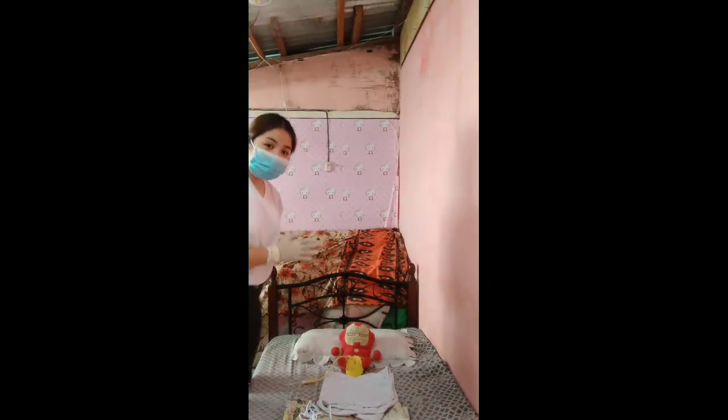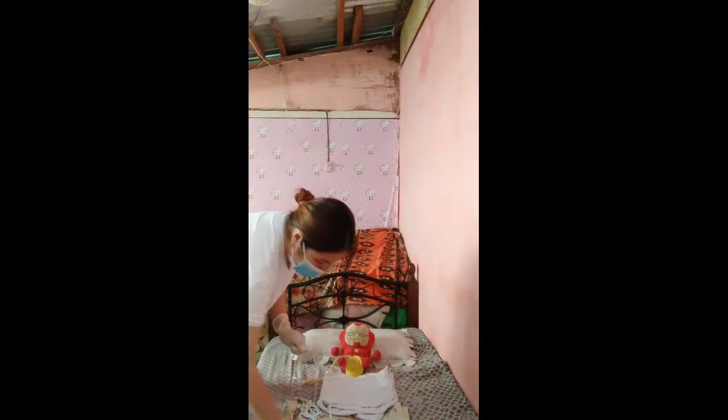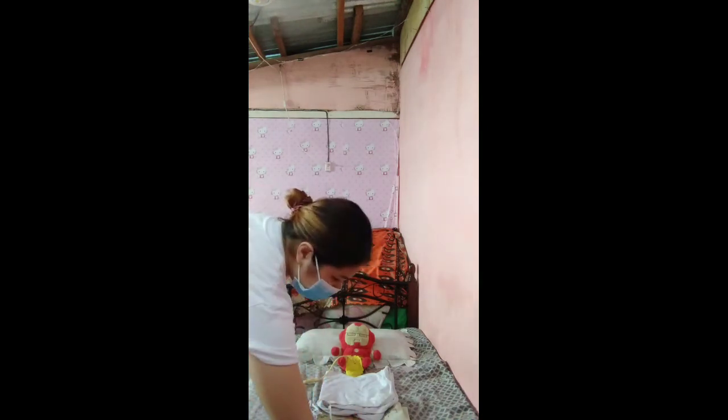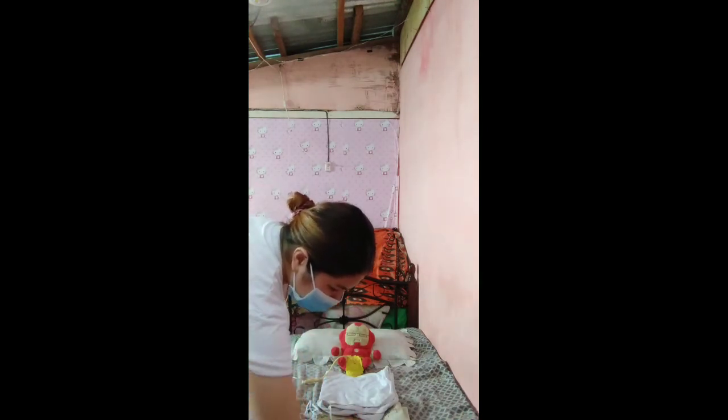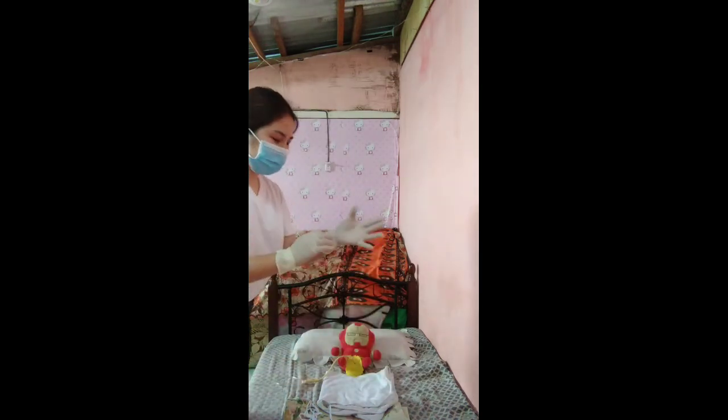And the next step is you need to dispose of all the materials that were used for the catheterization. So we need here, put that away. Sterile gloves.